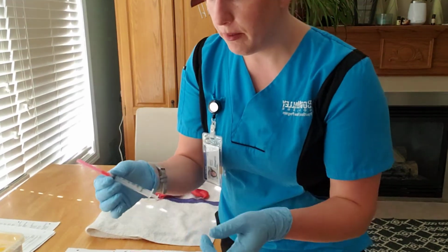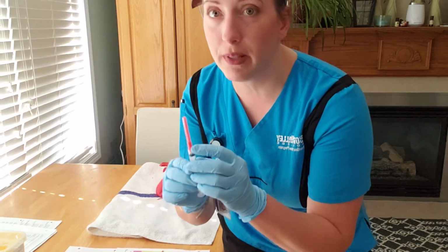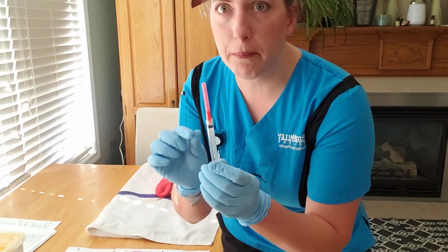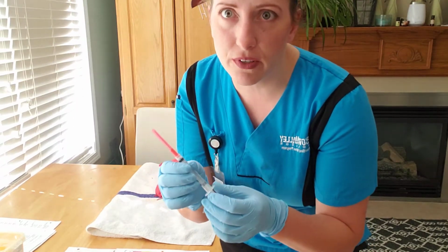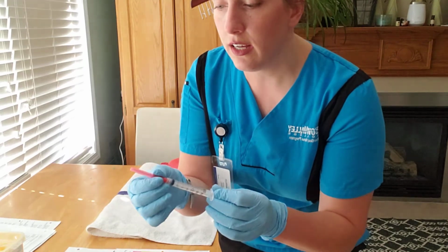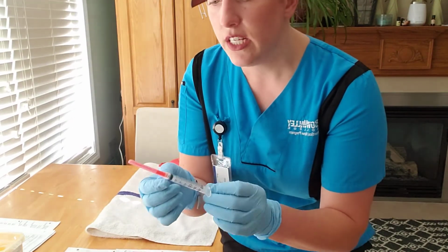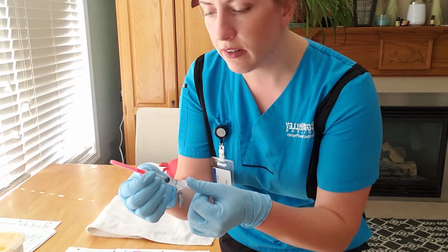So what I'm gonna do is I'm gonna pull back, I've got an 18 gauge blunt fill needle and I've got a 3 milliliter syringe. The 3 mils is because I only require 2 mils for the medication. So I've got the appropriate size syringe. And like I said, the blunt fill needle. So I'm gonna pull back 2 mils of air.